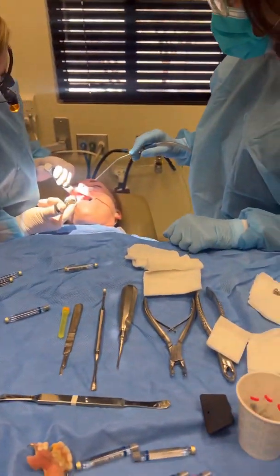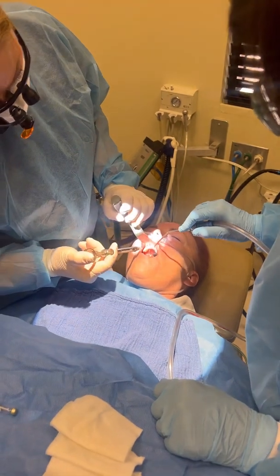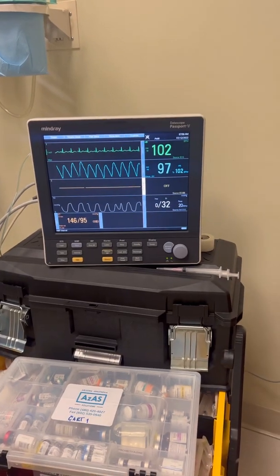She's strapped in — this patient did really well. We're localizing the mouth here, putting local anesthesia with some epinephrine, and you can tell the patient is not reacting to anything. That's my oxygen source there. She has a nasal cannula with a CO2 port and there is my monitor.